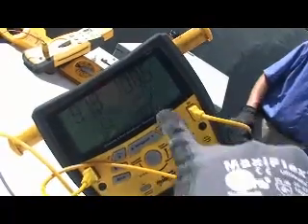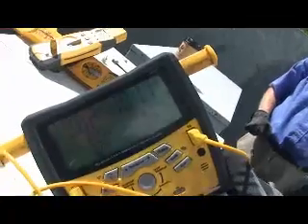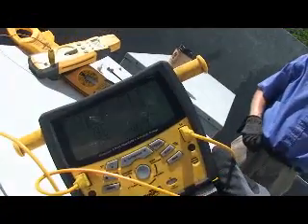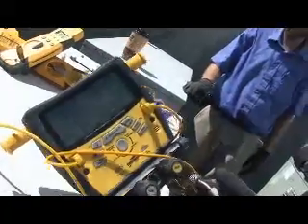Okay. And that's why you usually take it off your receiver. That pressure there is changing from the valves. You want a constant pressure from that receiver, but the door is stripped out, so.